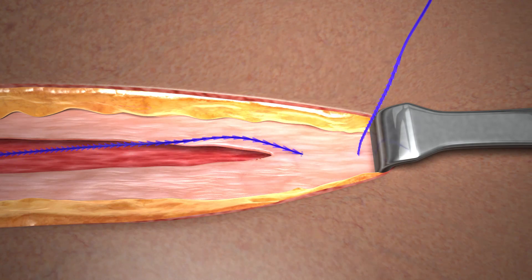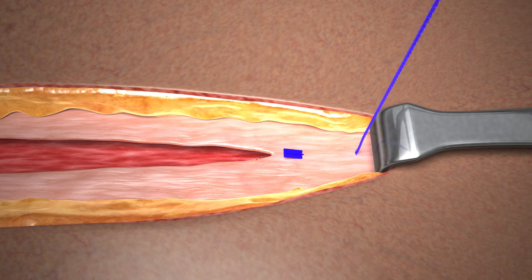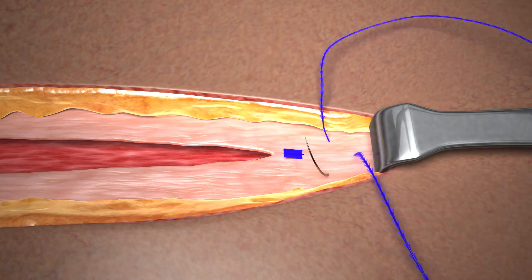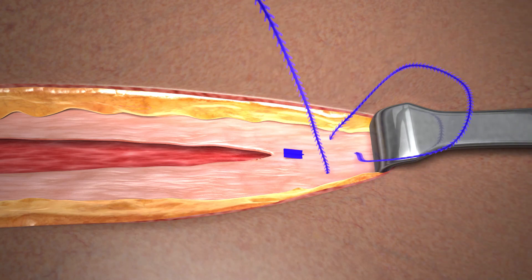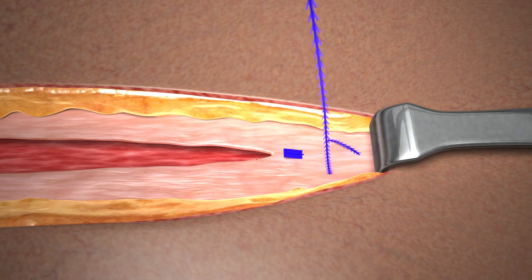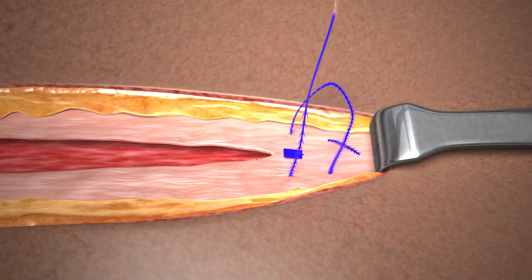To begin, take the first pass in intact tissue directly above the apex, in a direction away from the incision. Pull the device through the tissue to gently seat the fixation tab. The fixation tab should be seated above the tissue plane so that it remains visible. Do not exert additional force on the fixation tab or device. Moving toward the apex of the incision, take a pass in the intact tissue perpendicular to the initial pass to lock the stitch.